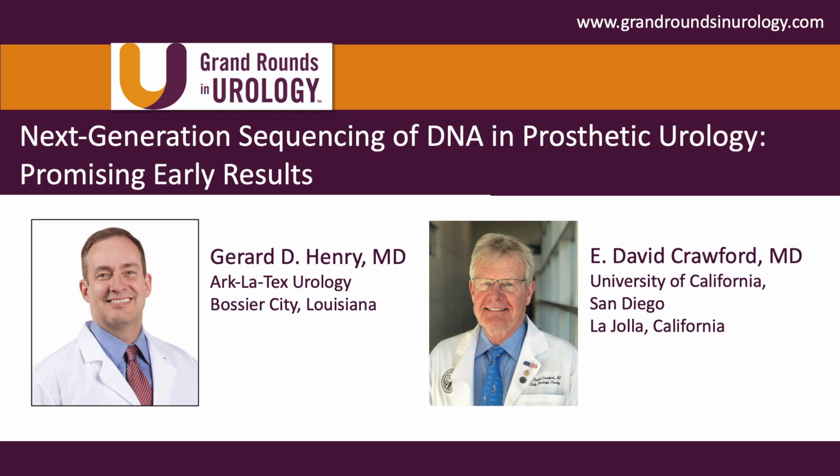So in the biofilm and infected prosthesis, the next-gen sequencing helps you identify what the organisms are that would not have been so easy to identify, or were not being identified, by standard culture? Not only helping it, when we get to our data here, it's showing statistically significant numbers of bacteria, but also bacteria I haven't even seen before on cultures.